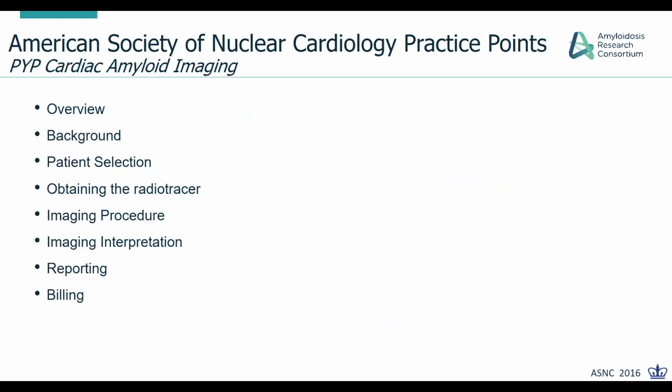The American Society of Nuclear Cardiology has an excellent practice point, which was recently updated a few months back, and in which they go into detail over overview, background, patient selection, obtaining the radiotracer, imaging procedures, imaging interpretation, reporting, and billing.